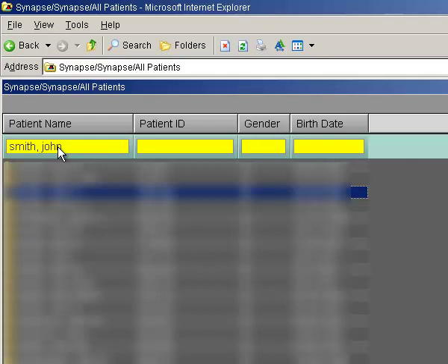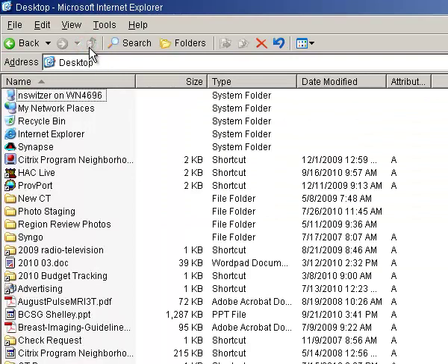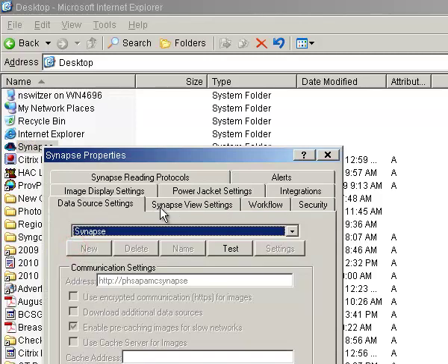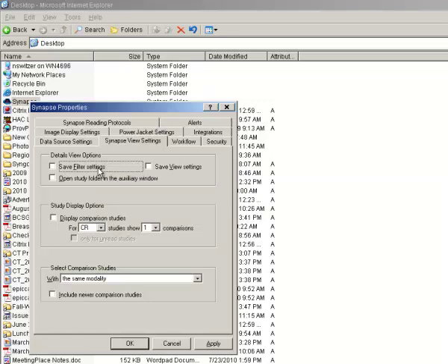Hit your up folder button three times with the left mouse click to get to a screen that looks somewhat like this. Then right click on the Synapse program information and select Properties with your left mouse button — the last entry in the list. The Synapse properties box will open with several tabs to choose from. Left mouse click the Synapse View Settings tab. You'll now be presented with several options you can select. We're going to check the Save Filter Settings checkbox like this. Click OK at the bottom of this gray box and you're done.